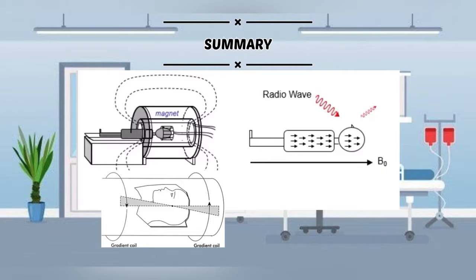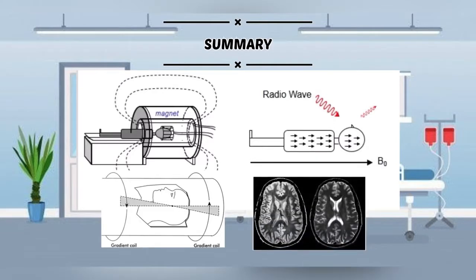The signal we measure then tells us about the amount of water in different parts of the image. For instance, the human brain. Thus, MRI has the ability to see such striking detail in contrast, as well as the ability to see blood flow and oxygenation change related to variation in brain activity. This is what makes MRI the powerful technique it is today.